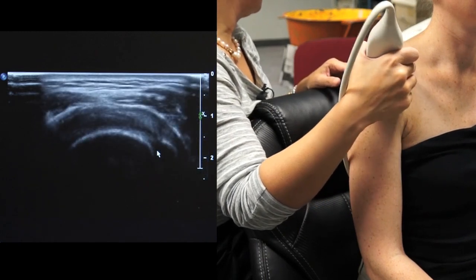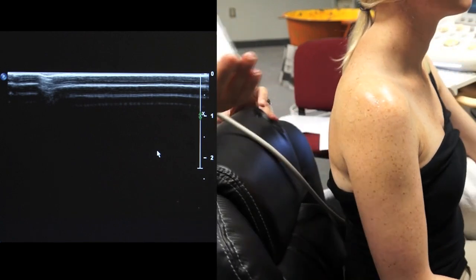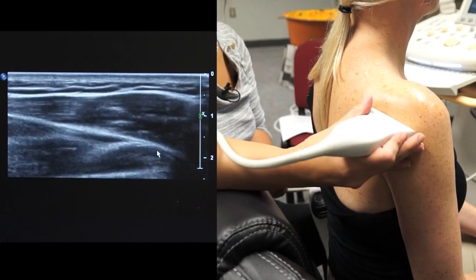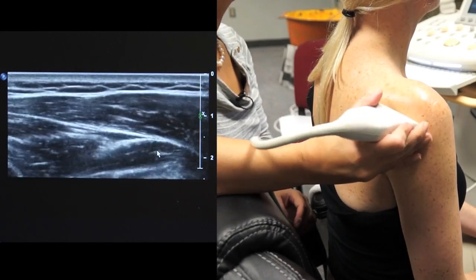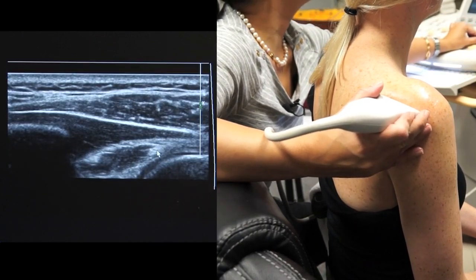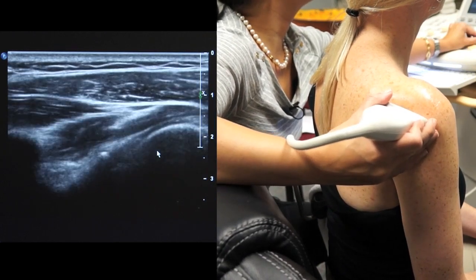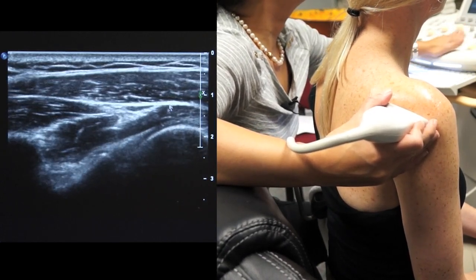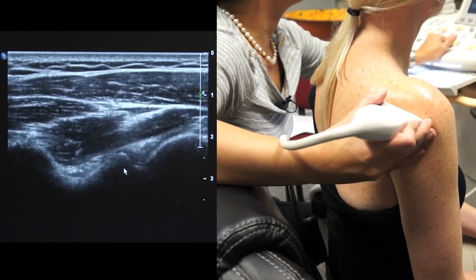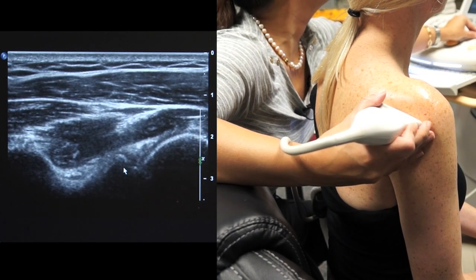Next, we can look at the glenohumeral joint. And typically, I scan that from the back. We do this in a transverse plane. Now it's a deeper structure, so we would have to adjust the depth, increase the depth now, because we're looking at a deeper structure. Okay, now since we were looking down here, we want to move the focus down to where we're imaging. See how that improves that image?